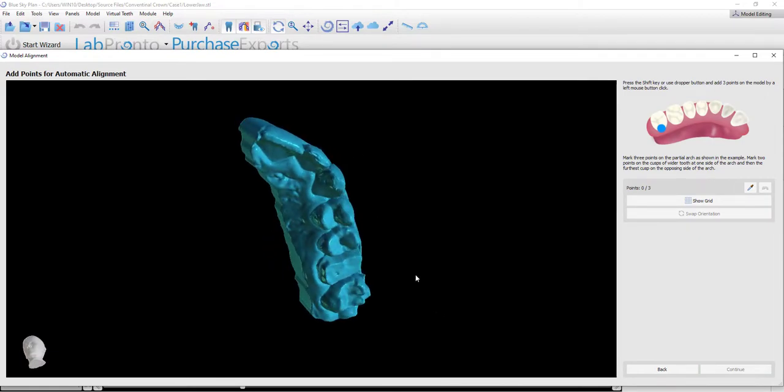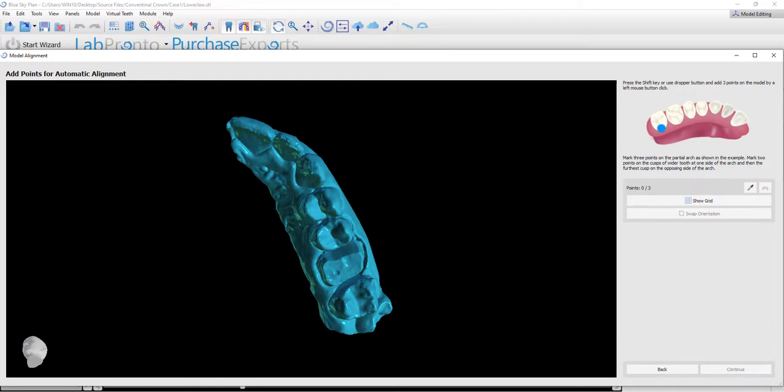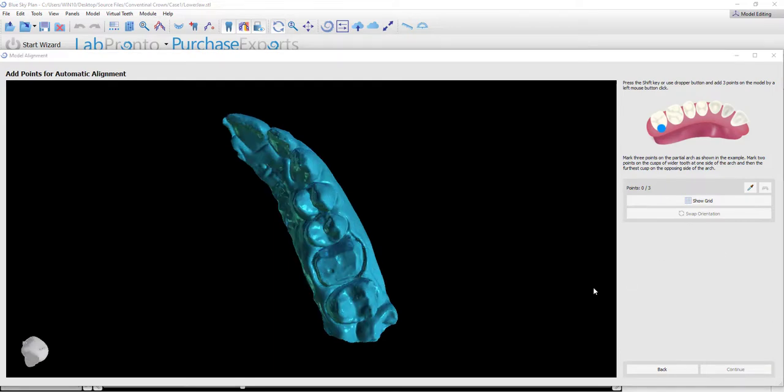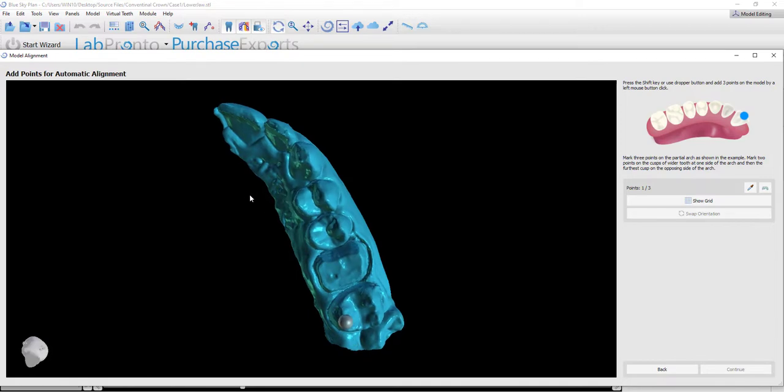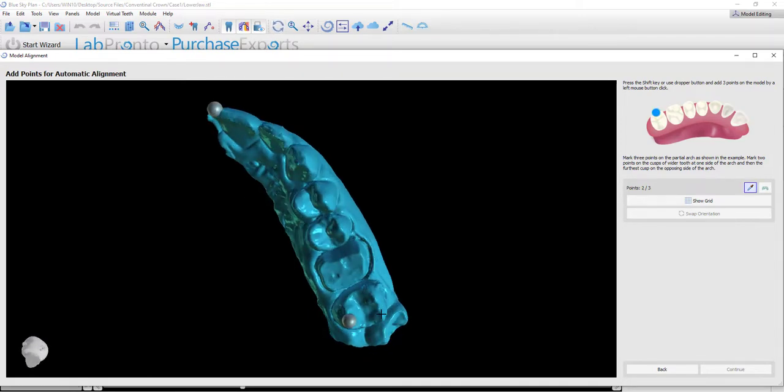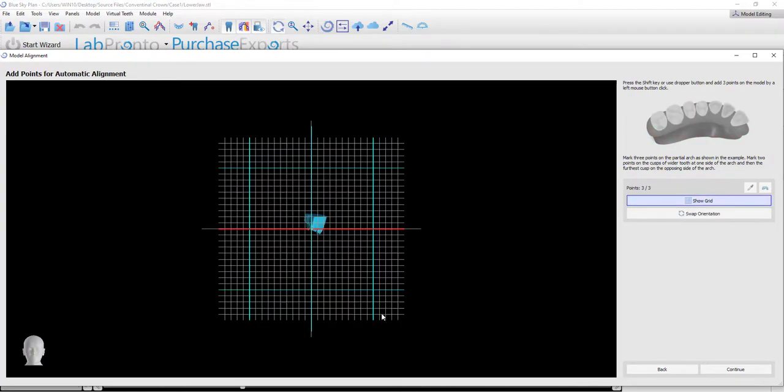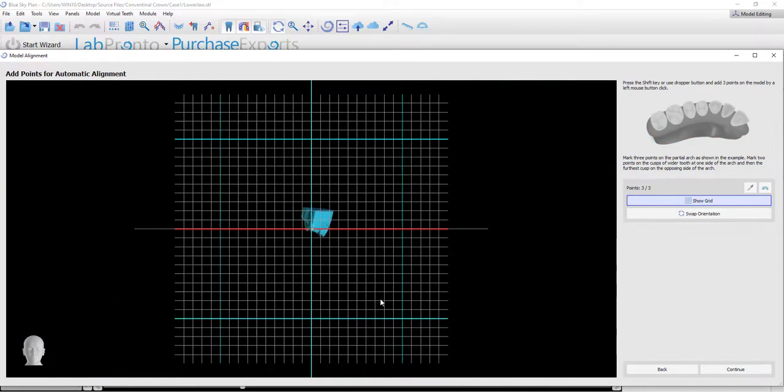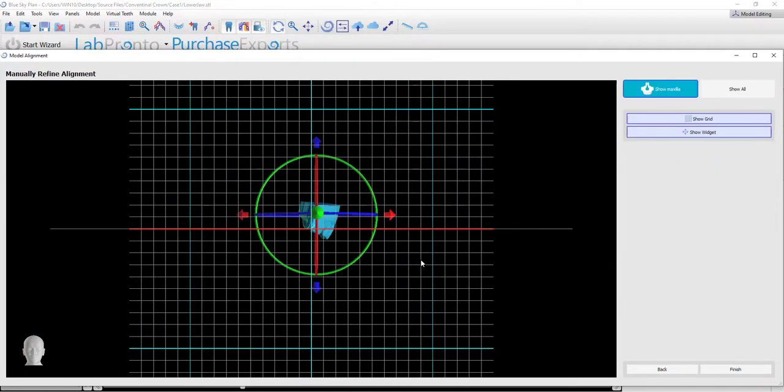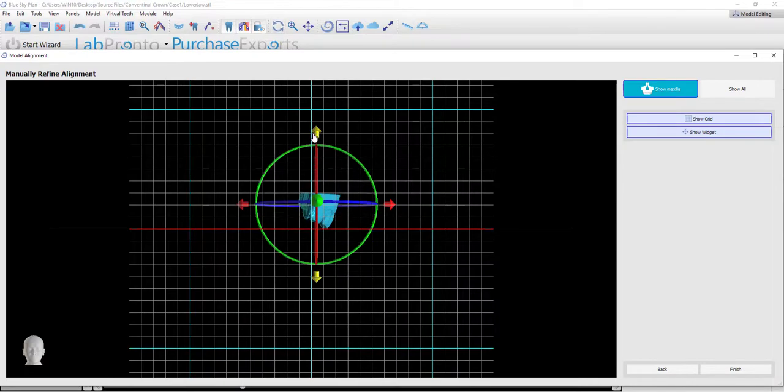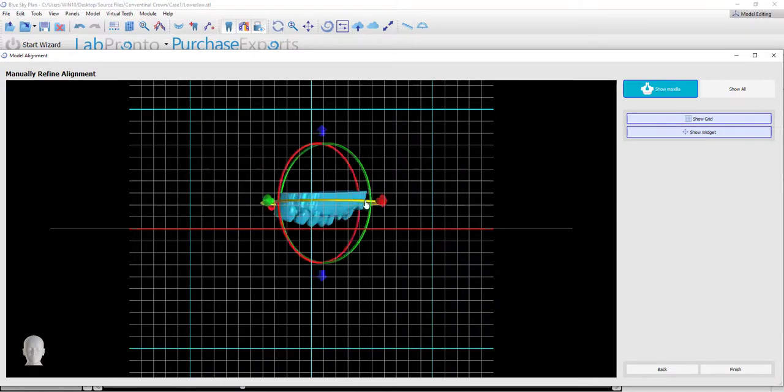The instructions and the image are instructing us to mark three points. We are going to mark one point on one side of the arch, the second point as close to the midline as possible, and the third point opposing the first point. Once three points have been marked, the software automatically aligns the partial arch. We are able to use the movement widget to fine-tune the orientation as necessary.